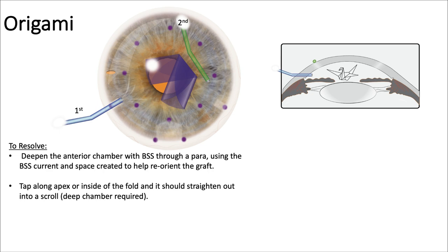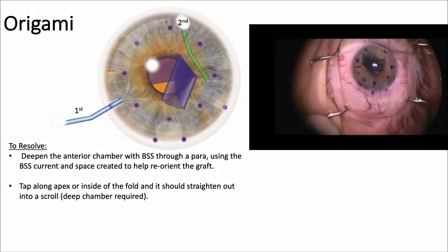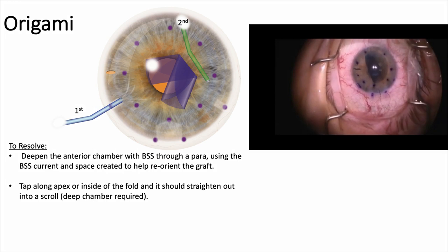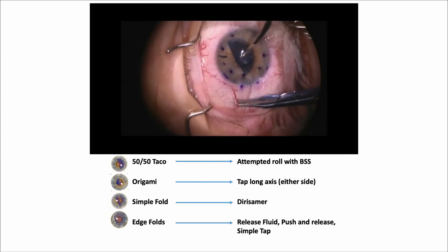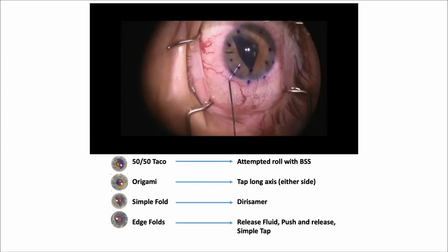Origami — this is a very confused-looking graft. Deepen the anterior chamber with BSS through the para, then use the BSS current and the space created to help reorient the graft. Tap alongside it with the green cannula to help straighten things out. That tends to work quite well — from this you'll go to a different configuration, which you can then solve.